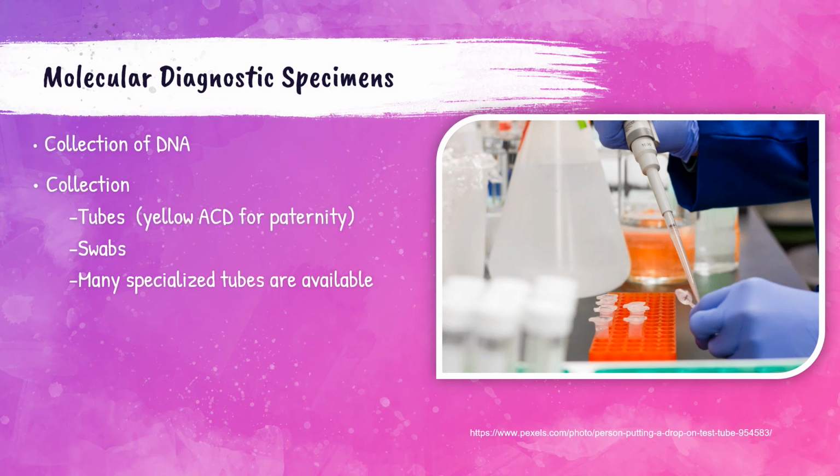Molecular tests can be used to identify DNA for forensic reasons, to diagnose different diseases by detecting the DNA or RNA of a virus or bacteria, or for paternity testing. So there are a lot of special tubes that are used for molecular testing, and the phlebotomist should follow their employer's policy on what tubes or specimens to collect from the patient for these types of tests.